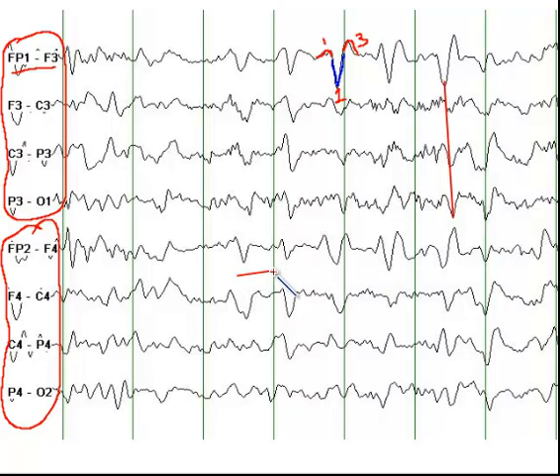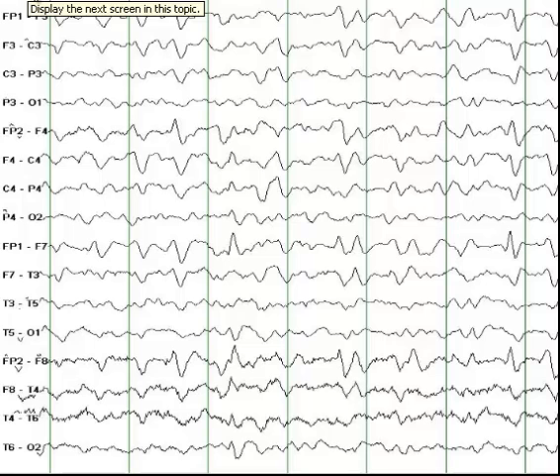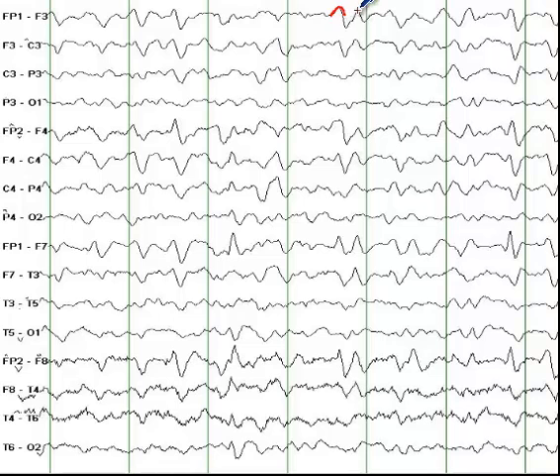You see that there is some degree of periodicity between all these triphasic waves — they seem to come at a specific interval — but you do not see a whole lot of evolution. There is some waxing and waning, but you do not see significant evolution in the waveforms. Moving to the next page, you have the first phase here, the second phase, two negative phases, and then the positive phase — the highest amplitude is at the positive waves.